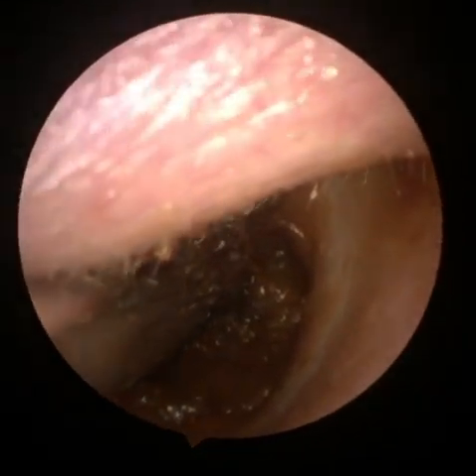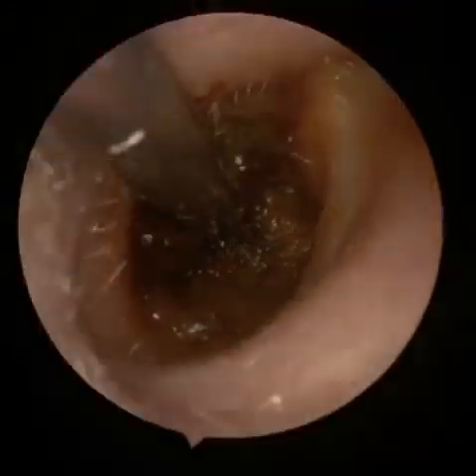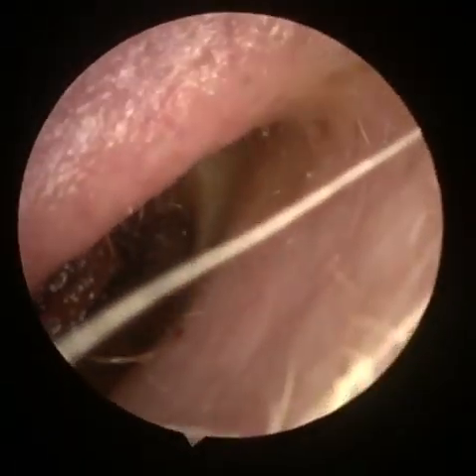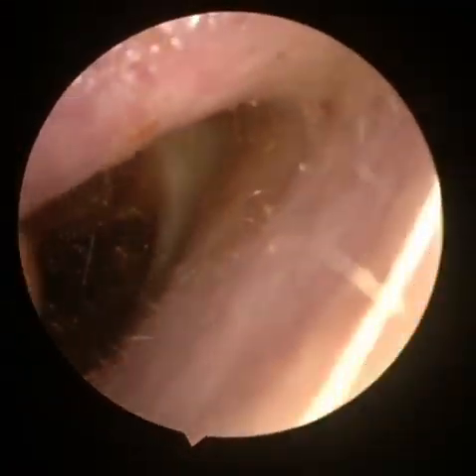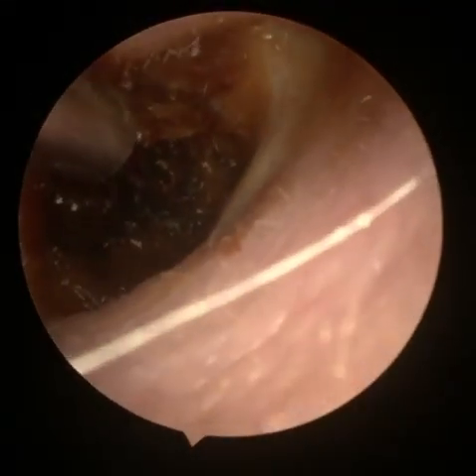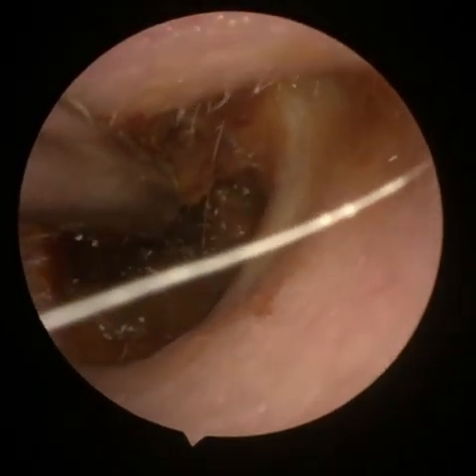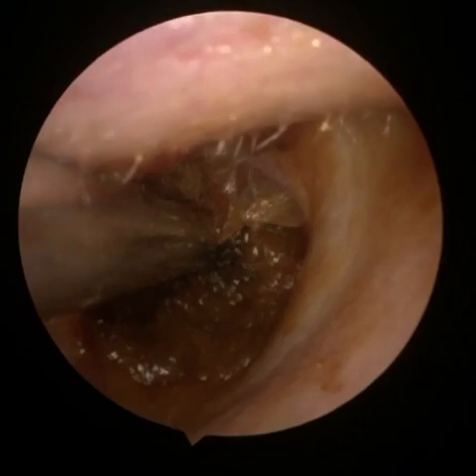We're trying to get adequate suction now. We're using state-of-the-art equipment in the form of a handheld endoscope with probably the best acuity you're going to get in terms of the field of view inside the canal. You'll notice a little bit of keratosis going on there as we move the wax away from that drum.